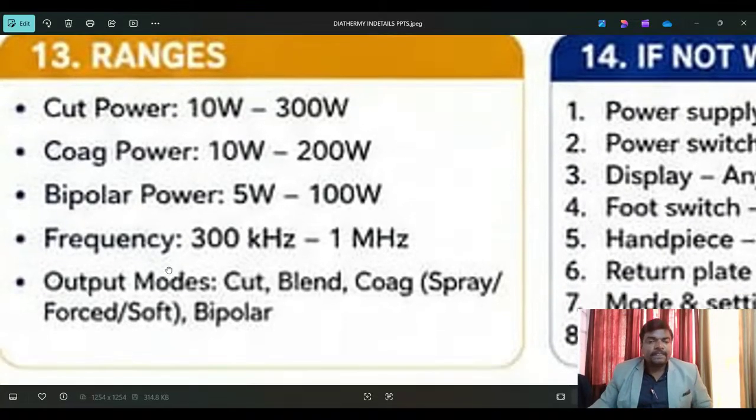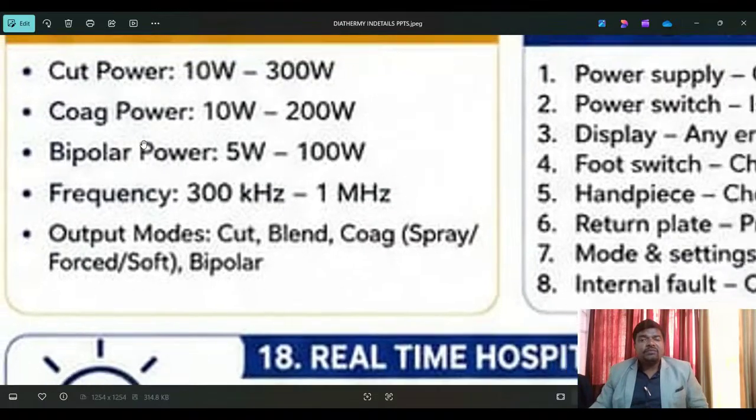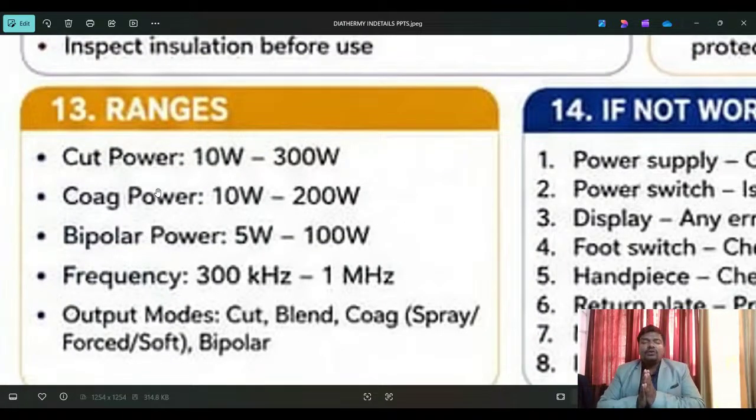Okay, right. Here the frequencies, here the ranges. We have to know the normal ranges. For any medical equipment you have to know up to that level. Sometimes some biomedical engineers think that if anything happens continuously, the equipment will blast. There is no chance of a blast, because as biomedical engineers we have to focus technically on what is inside the machine, and there are no explosive things. A blast means a minor blast that happens because of electrical fluctuations. Why does a blast come? Because the inside components, active and passive, have limited specifications, and limited components are fixed on this PCB board.